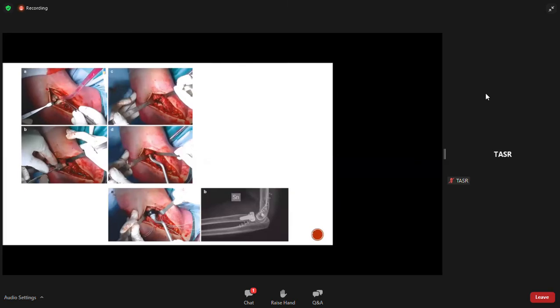So here there is another way, and as you can see here, there are very nice images on how to expose the radial head. So the big difference to me is: is the LCL detached or not? If it's detached, my suggestion is to dislocate posteriorly or subluxate posterolaterally the radial head with a normal retractor posteriorly and anteriorly. On the anterior side, try not to be too aggressive because the nerve is very close, and work on the stem to implant your prosthesis.